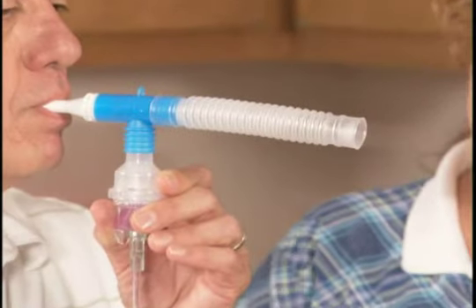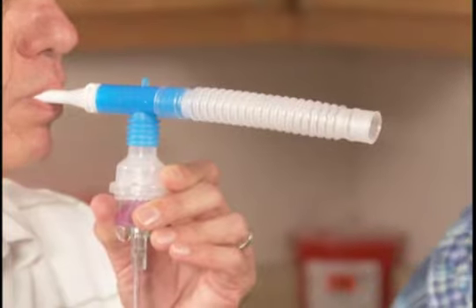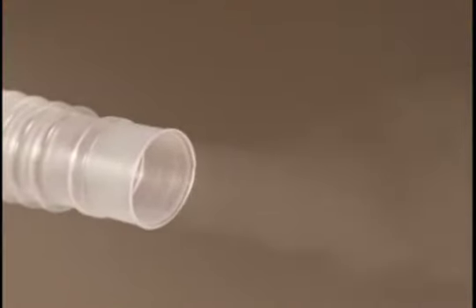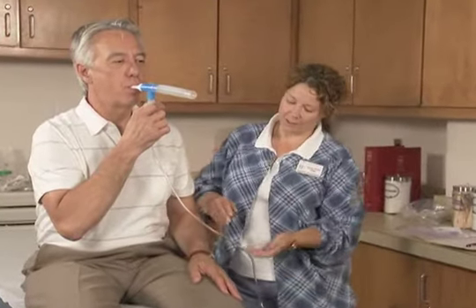When the patient is ready, turn the nebulizer on. The medication in the reservoir cup will become a fine mist to be inhaled by the patient, and you will notice a fine mist coming from the opposite end of the T-piece as the patient exhales. The treatment typically takes about 15 minutes.